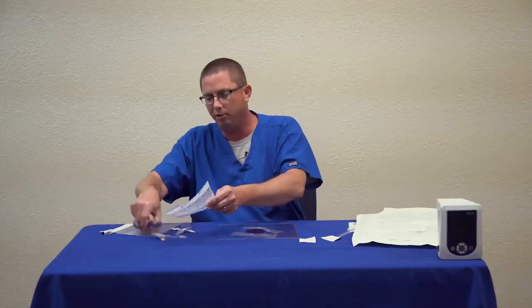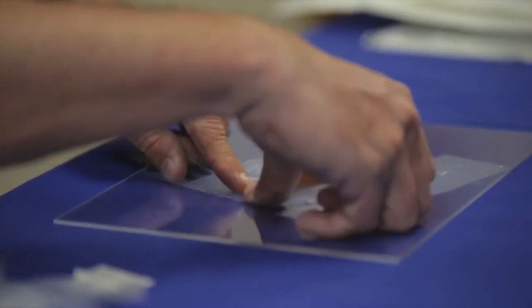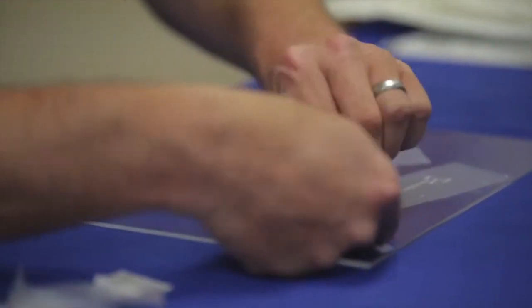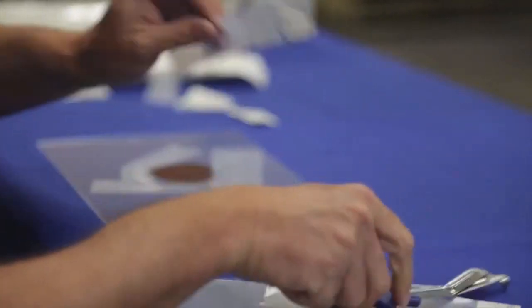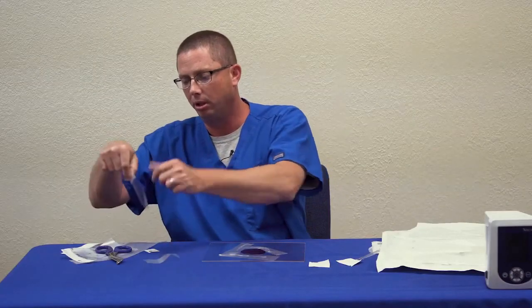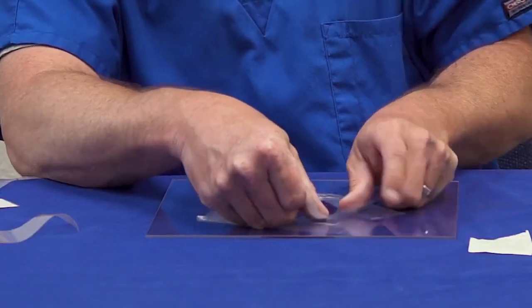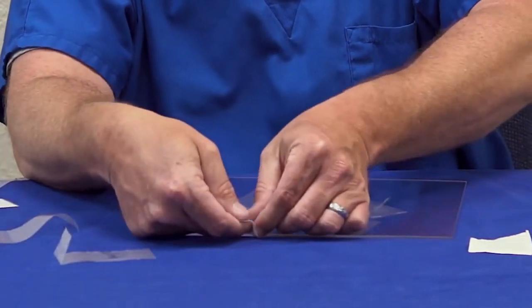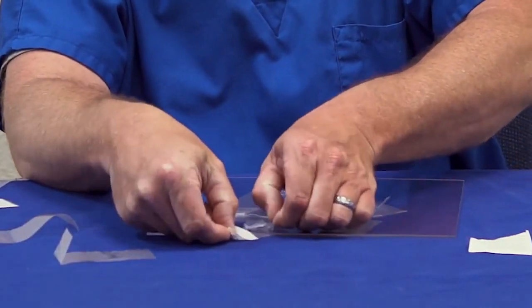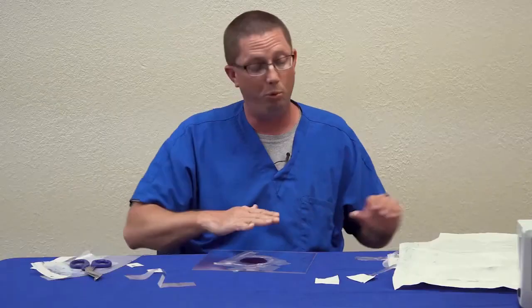Need about 2 more pieces for this. So this is the last piece I'm cutting for the window paning around the wound. I'm going to line this up and go around the wound margins. Remove number 2. Remove number 3. So now I have my wound window paned.